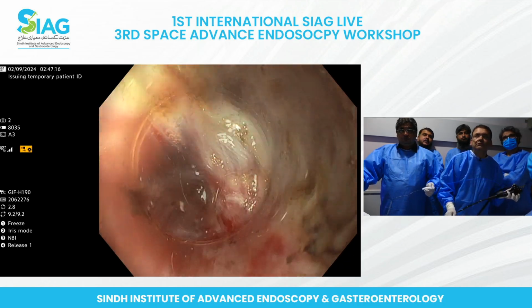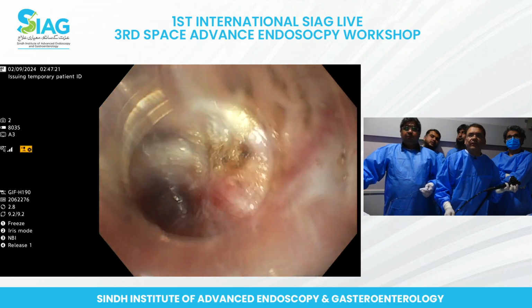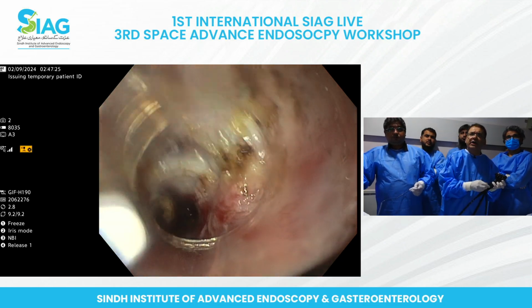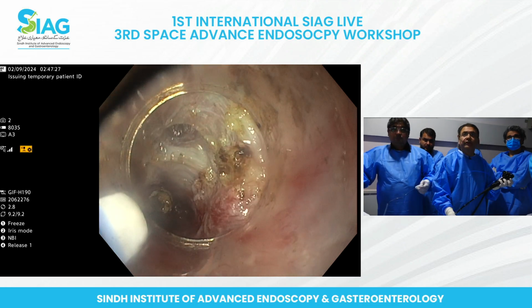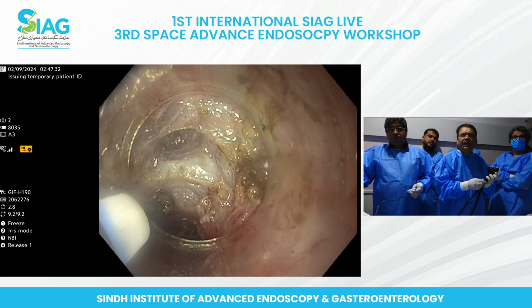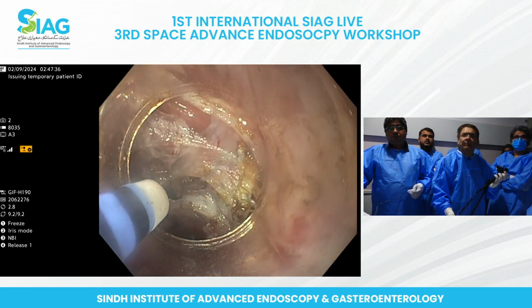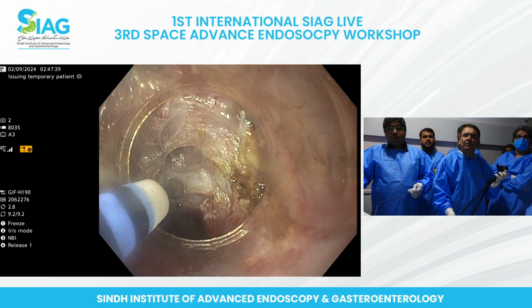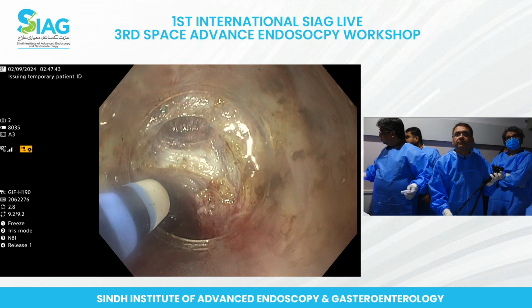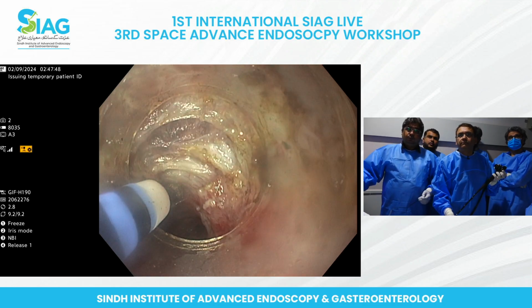We are almost done here. I'm going to cut this last fiber, and then I'm going to come back and close it. So we're going to go to Mustafa. When he's ready to do the gastro-J, if you want to come back, I'll start closing. You let me know if you want us to come back for a bit. Well done, Khalid, that was quick and very, very impressive.